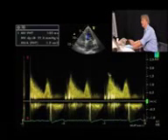You do not need to pull the cursor all the way down to the 0 line. It's enough if you go somewhere towards here. And there we get an opening area of 1.8 square centimeters. So very easy to perform.